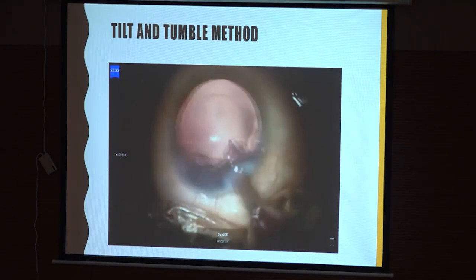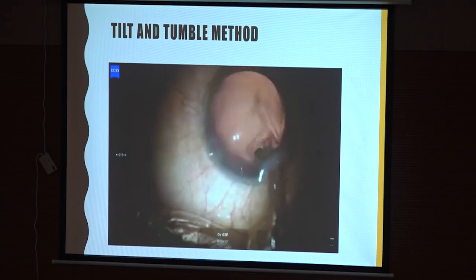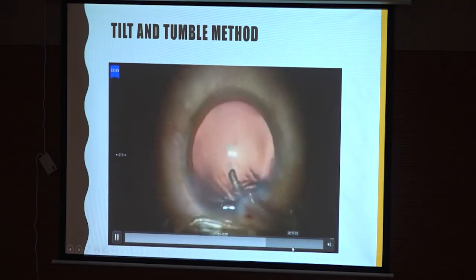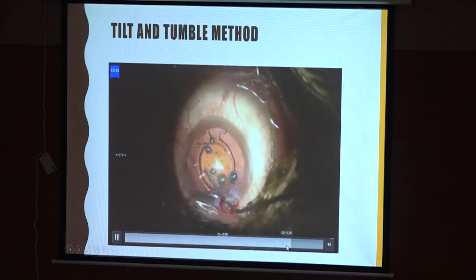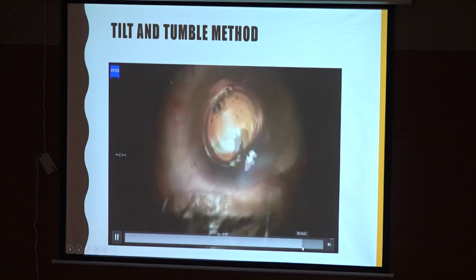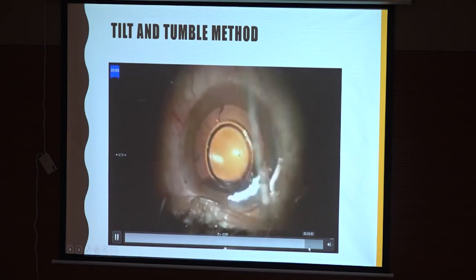But if you coat the endothelium nicely, no harm will happen to the patient. So again, a single piece has been implanted in the bag.